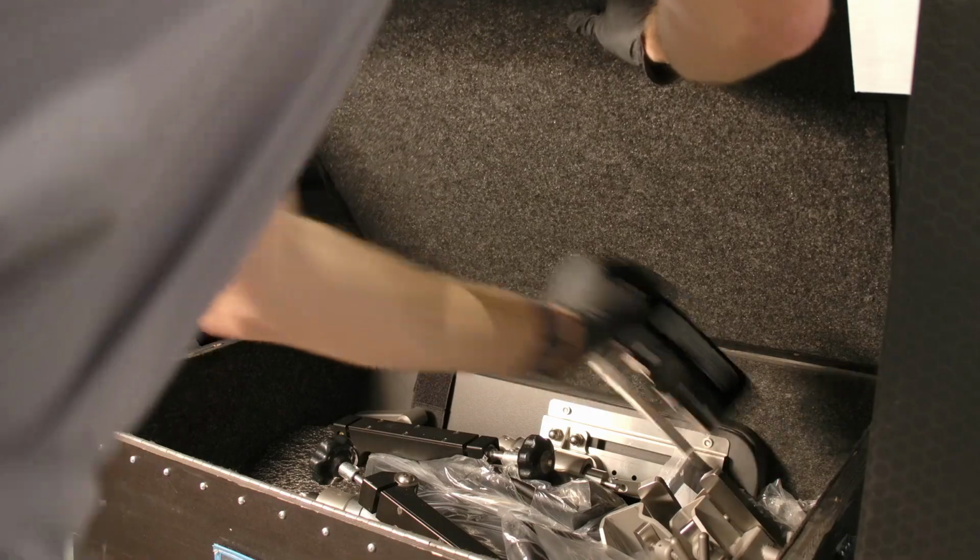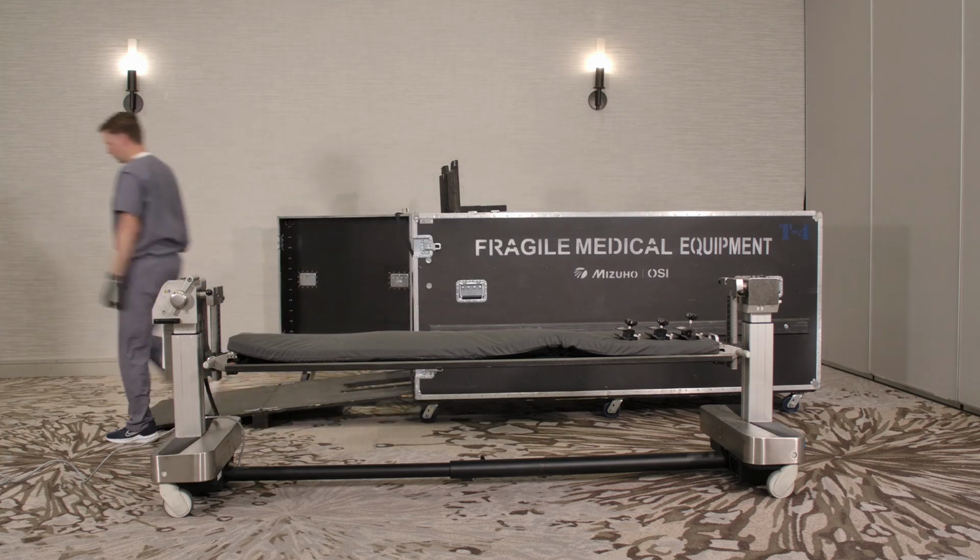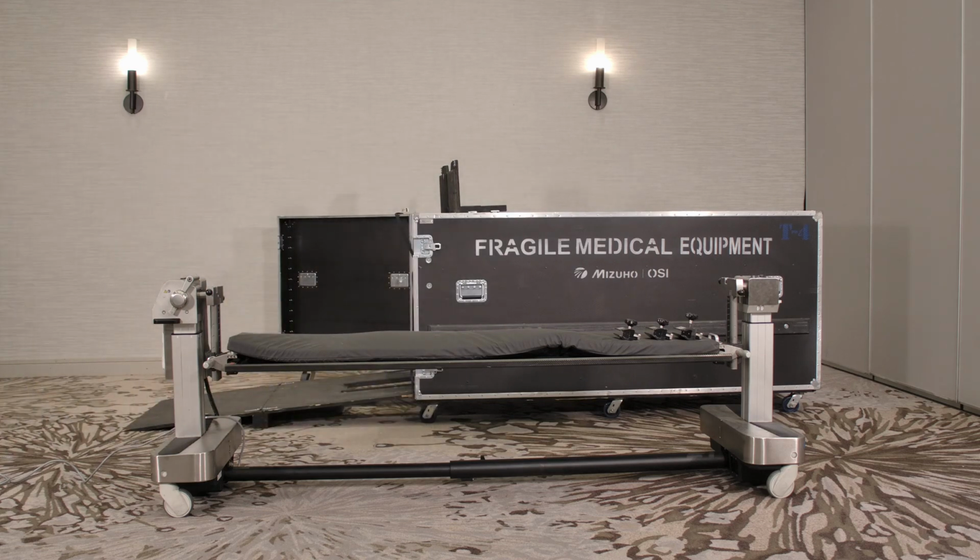In the back of the crate, find 3 of the Trios universal side rail mounts. Take the 3 Trios universal side rail mounts and set them on top of the table for the upcoming lab. The setup of the radiolucent top table on the Trios is now complete.